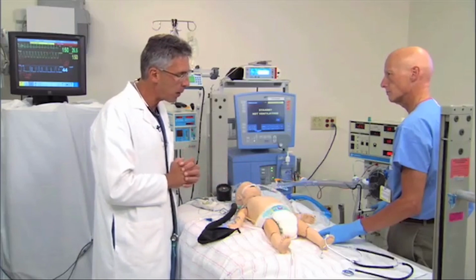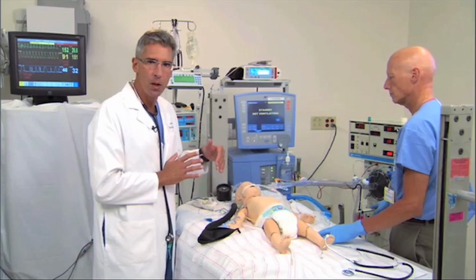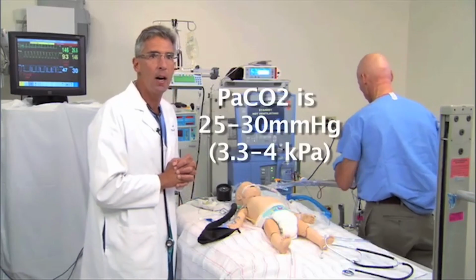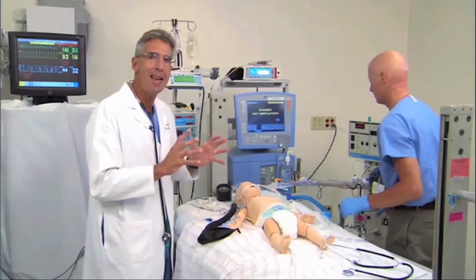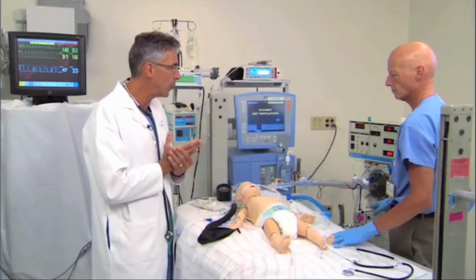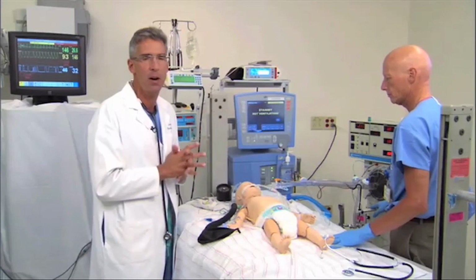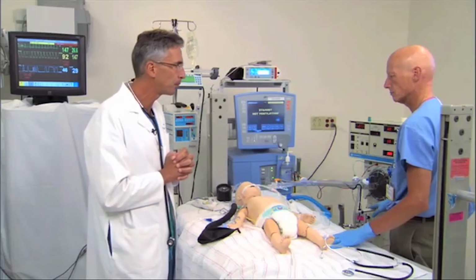I'm much happier doing that than over-ventilating the patient. Particularly in this patient population, the oscillator is a very efficient remover of carbon dioxide. So I think the worst scenario is to have that first blood gas return. The PCO2 is 25 or 30. The tendency is to congratulate oneself, but I think that's the wrong response. That is too much use of the ventilator. So remember, we are focused mostly in pediatric critical care on the pH. So as long as the pH is above 7.2 or so, I think we can adjust the minute volume on the oscillator and achieve a reasonably physiologic pH.